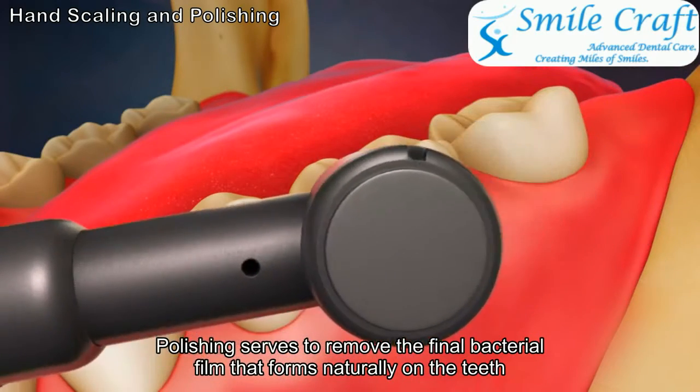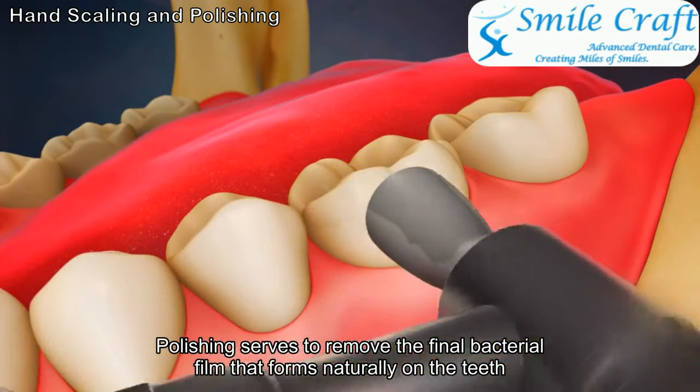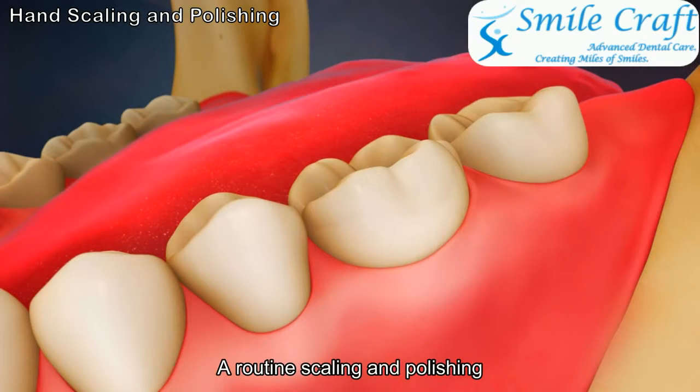Polishing serves to remove the final bacterial film that forms naturally on the teeth. A routine scaling and polishing is an excellent way to establish a healthy baseline of cleanliness.